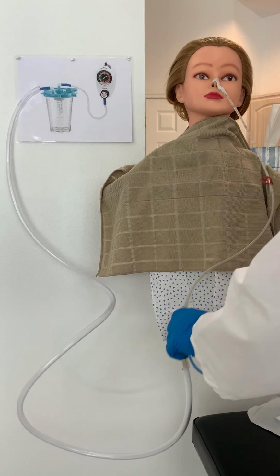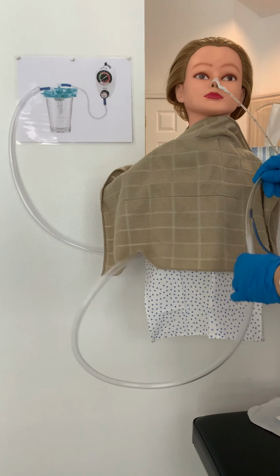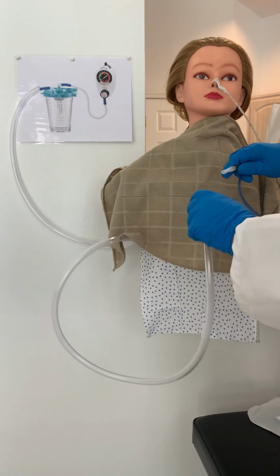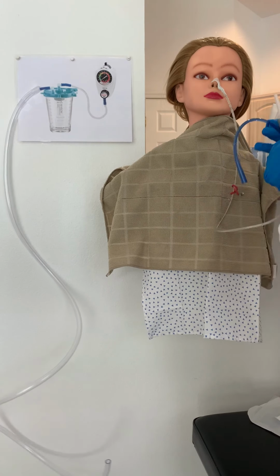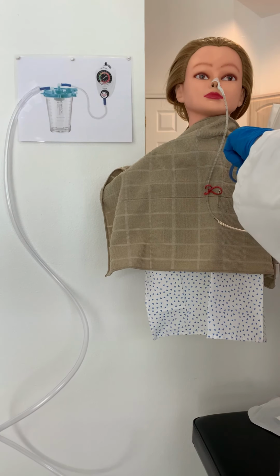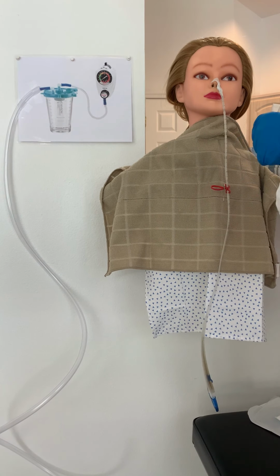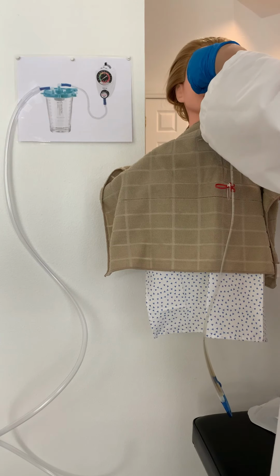And then we're going to turn off the suction, so we'll flip that switch to off, and we can disconnect the tube. All right, I'm going to clamp that so it doesn't leak. All right, so I'm going to loosen this tape here.